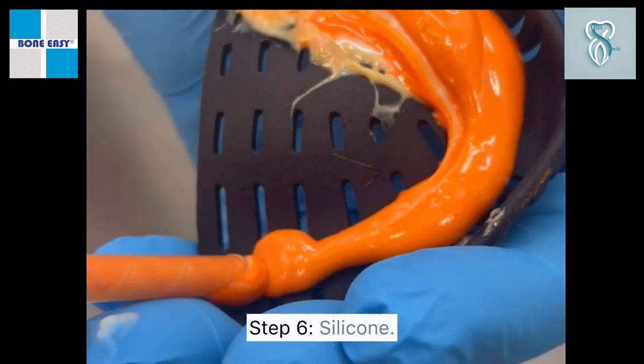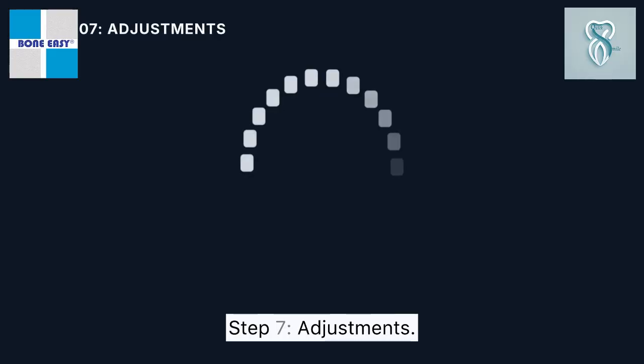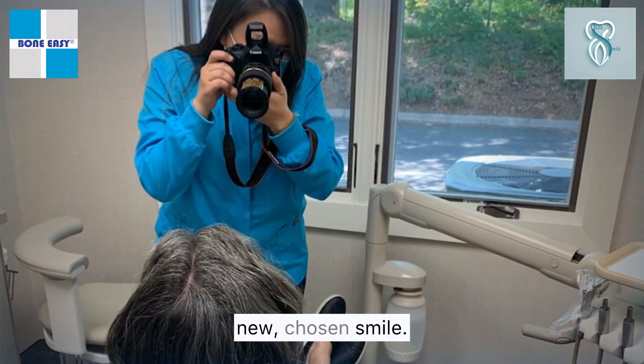Step 6. Silicone. Apply silicone and seat the assembly in the patient's mouth. Step 7. Adjustments. Fine-tune the medial line and the occlusion plane for a perfect fit. Step 8. Patient approval. Take a picture to show the patient their new chosen smile.